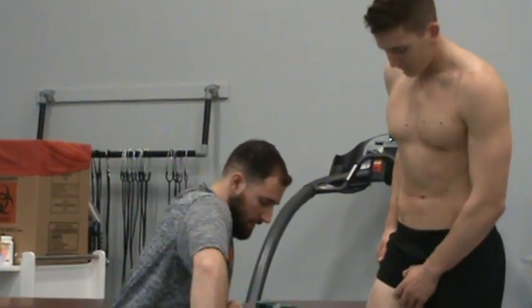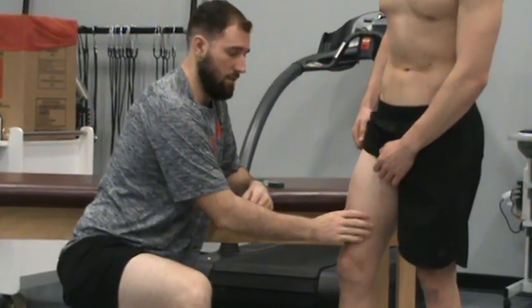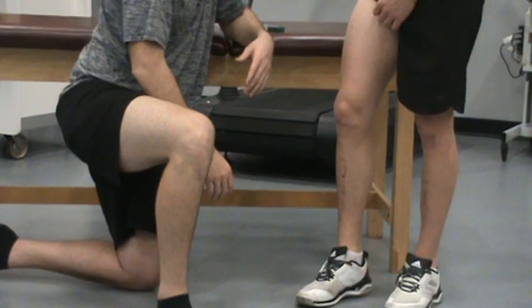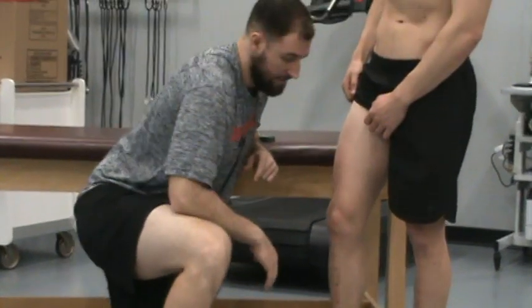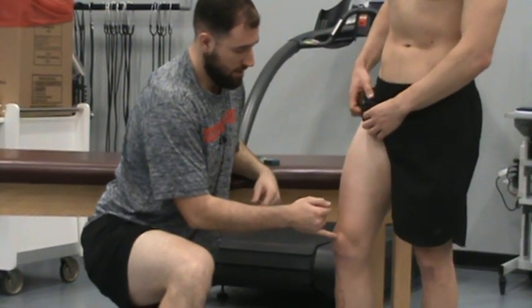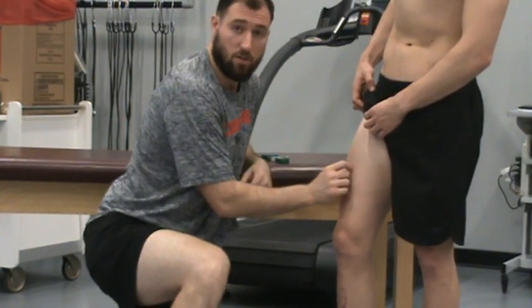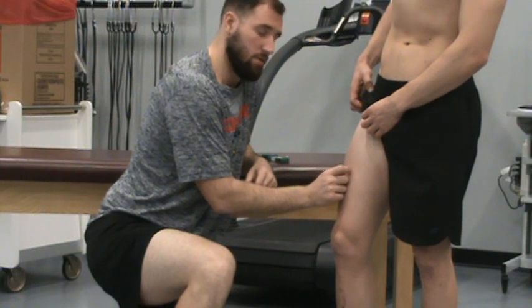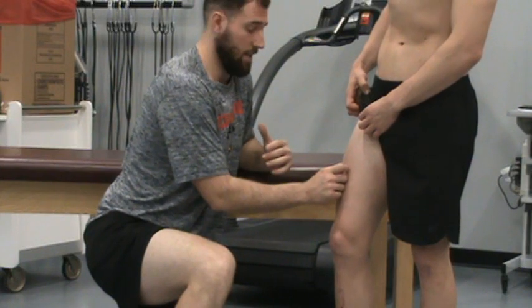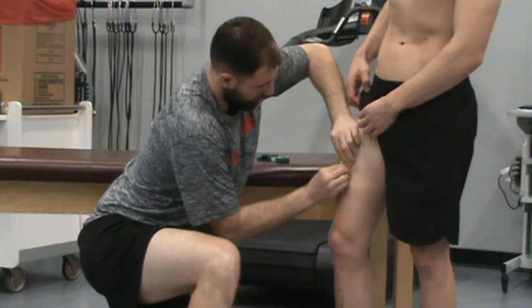Last one — the thigh. You want to make sure the person is not bearing any weight in that leg because we want it to be totally relaxed. He's going to bend a little bit, making sure he can pick up his leg without falling. This one is halfway between his inguinal crease and his patella. This one is pretty tricky because most people have a lot of muscle in their thighs, so don't be afraid to dig in there to get as much skin up as you can. I get in my fold and take my reading.